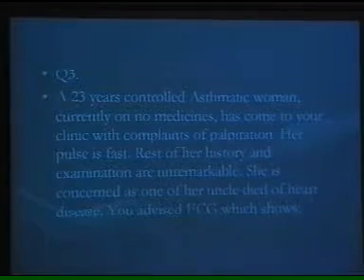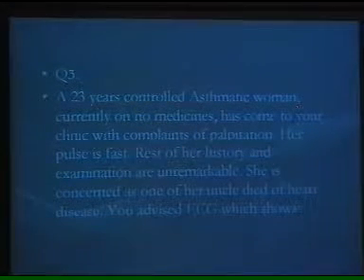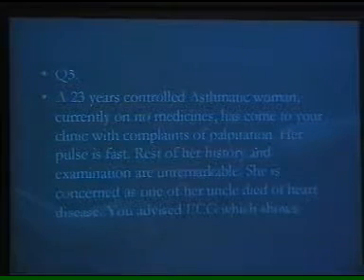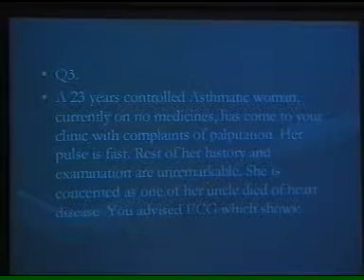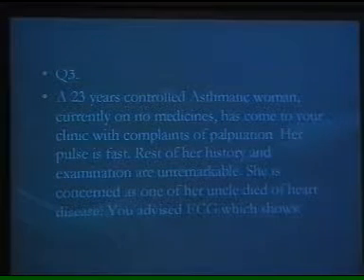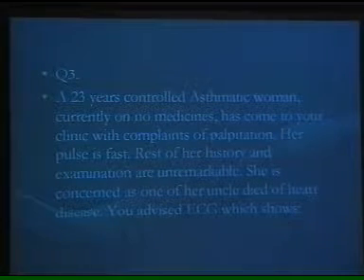Yes. Another scenario: a 23-year-old controlled asthmatic woman, currently on no medication, has come to your clinic with complaints of palpitations. Her pulse is fast. The rest of her history and examinations are unremarkable. She is concerned as one of her uncles died of heart disease. You advised an ECG which shows something.